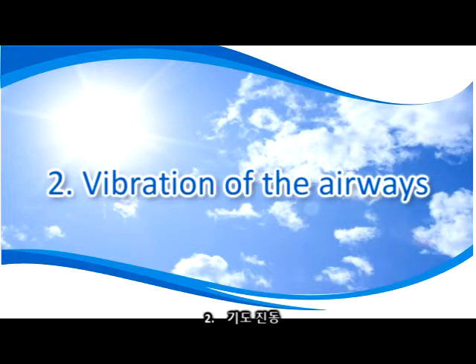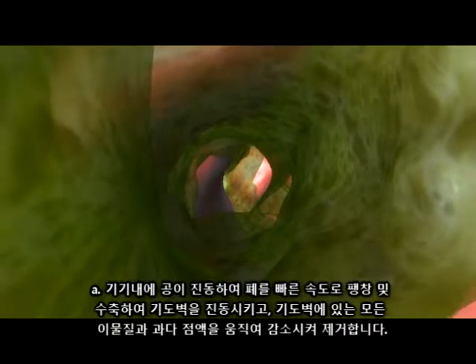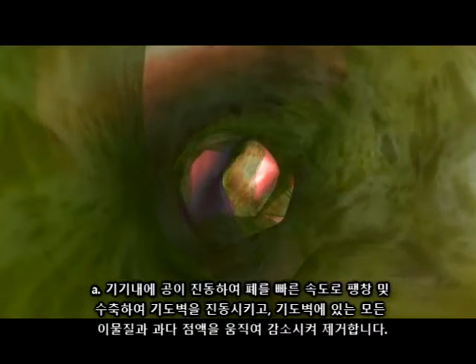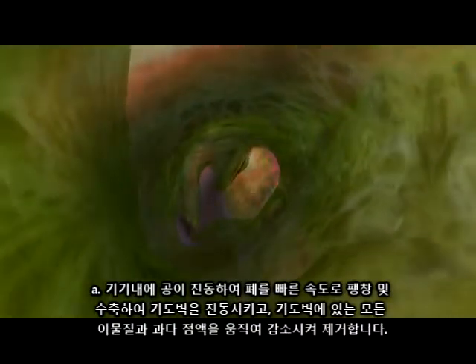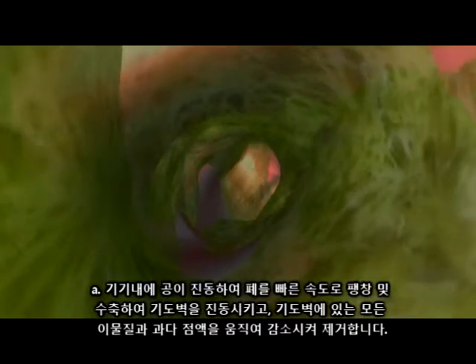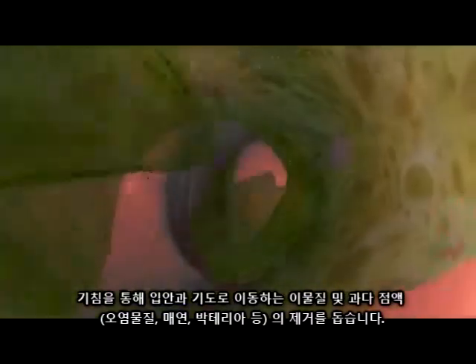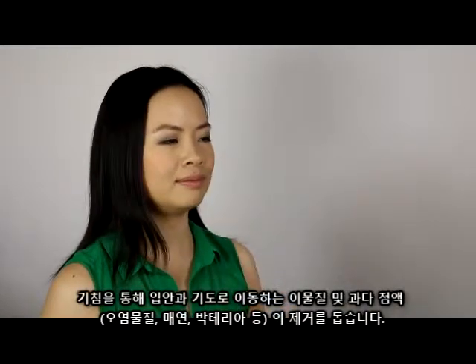2. Vibration of the airways: The ball will vibrate in the device, which causes your lungs to inflate and deflate at a high rate, causing the walls of the airway to vibrate, helping loosen and shake loose any blockages and excess mucus from the airway walls for removal. These blockages and excess mucus, containing the trapped pollution, smoke and bacteria, travel up to the airway and into the mouth, to allow you to remove them from the body through coughing.